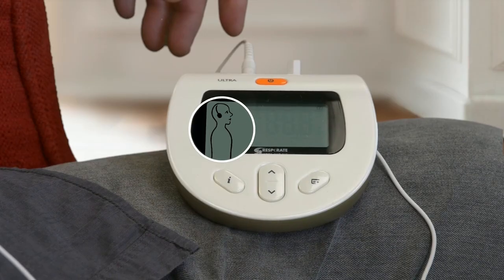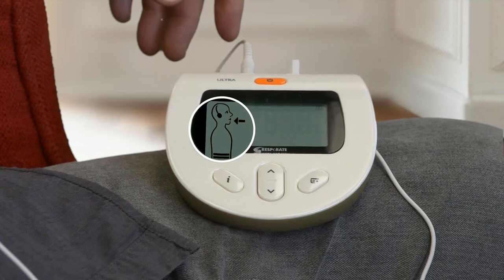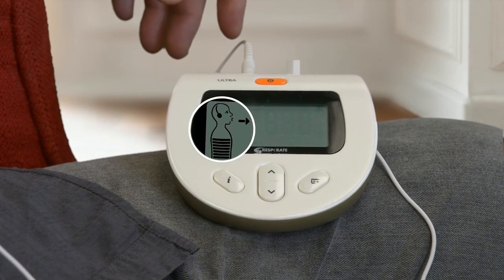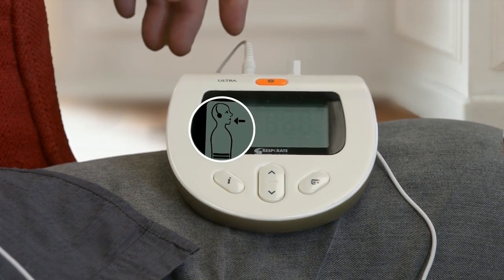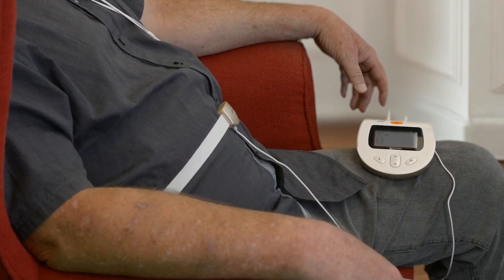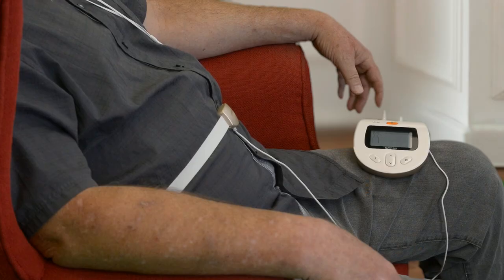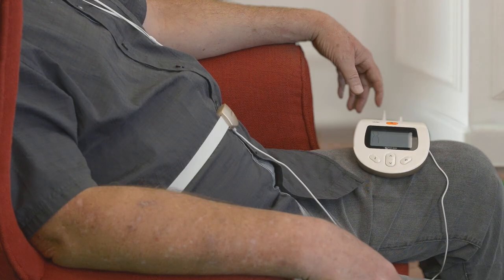Lean back and breathe according to the voice instructions. Breathe in. Breathe out. In. Out. In. Out. In. Out. Great. This is where you should place the sensor.